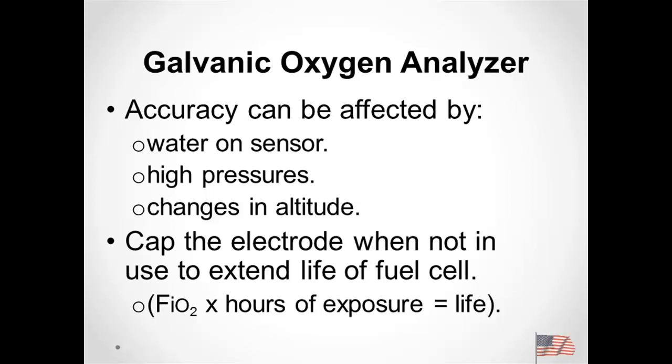So if I just had that sensor sitting out, even though it's not turned on, this sensor is still consuming oxygen. So we have to cap it, okay? Because there's oxygen in the room that's going to interact with that in an oxidation reduction reaction. I don't care that you know the hours of exposure, all that kind of stuff. But basically, the more oxygen you have in the environment that you're analyzing, the shorter the life of the analyzer. Duh.